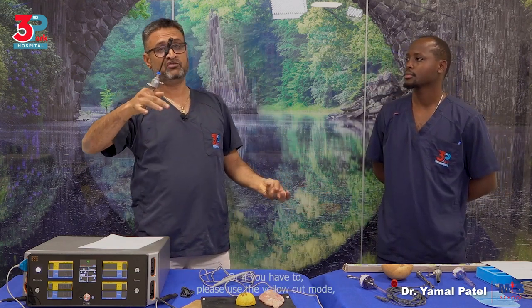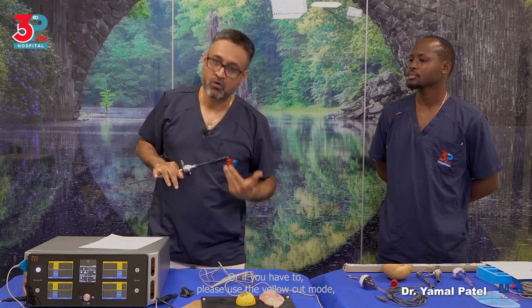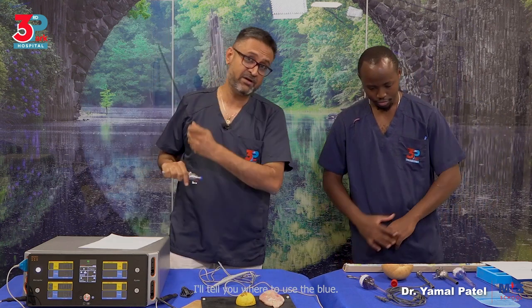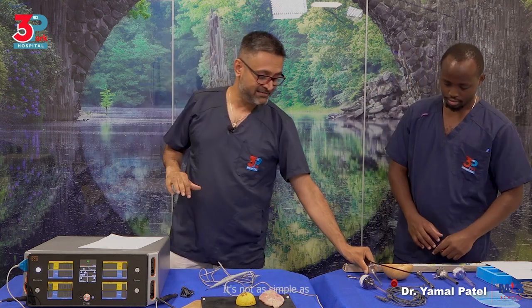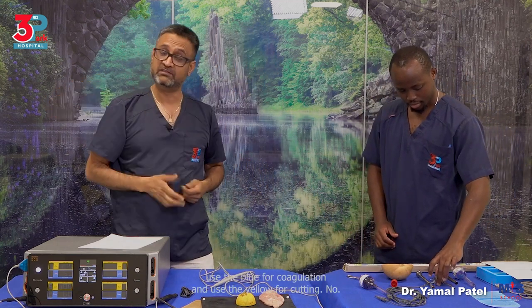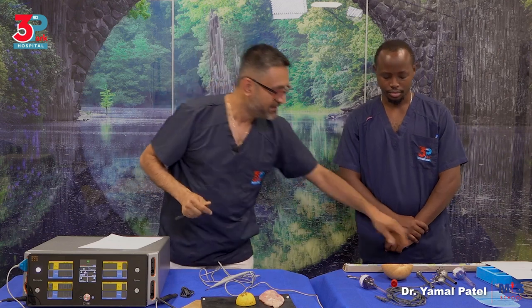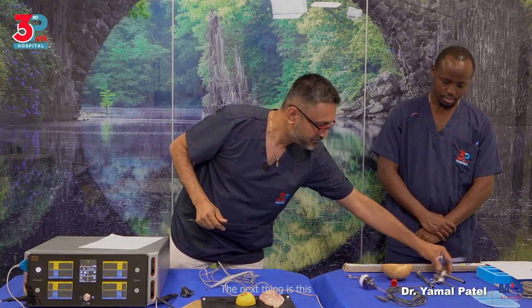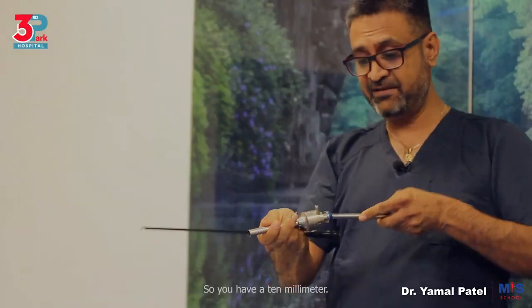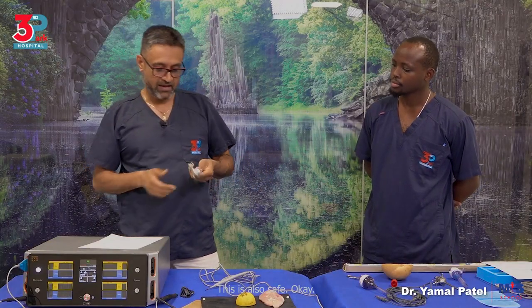Or if you have to, please use the yellow cut mode, which is the low voltage mode, more often than the blue. I'll tell you where to use the blue. It's not as simple as use the blue for coagulation and use the yellow for cutting. No. The next thing is, this is also safe. So you have a 10 millimeter, you have a reducer, and you do this. This is also safe. Okay?